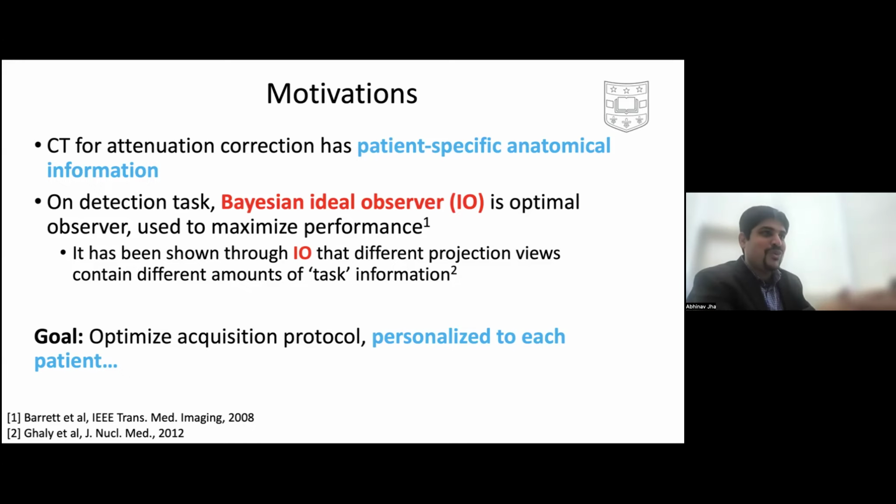that if I start off with less information, I'm not going to synthesize new information, right? So let's start with the data that has the most information, and then do the reconstruction. The idea is that the reconstructed image will therefore have more information. Is there a way to get that model observer in projection space? It is tricky, because an anthropomorphic observer works on reconstructed images. Human observers don't look at projections, right? They look at reconstructions. So if you want to emulate a human observer, you have to use an anthropomorphic model observer. As much as I would like that, if you have to do a clinically relevant study, you have to work with the human observer. That's good. Yeah.